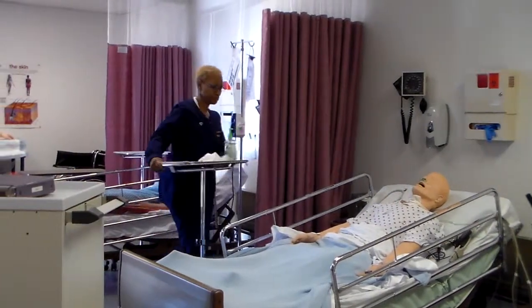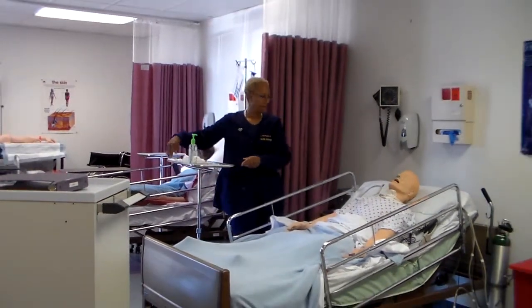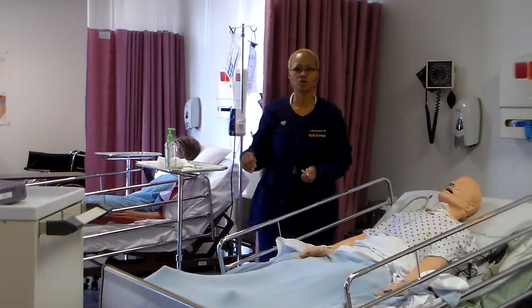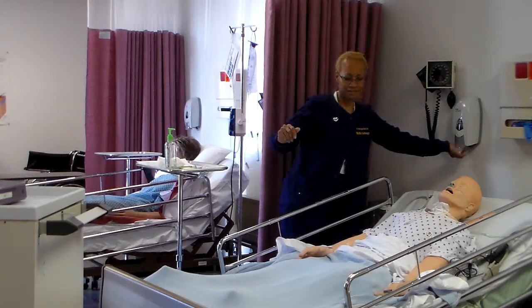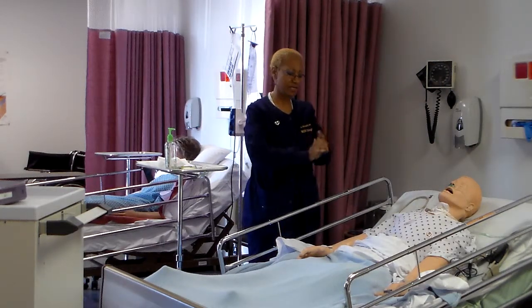Come in and introduce yourself, Mr. Johnson. My name is Annette. I'm your nurse for today, and I'm here to deliver your medication. We've been in earlier, so he's well aware of that. You're going to make sure that you wash your hands. Wash your hands, and then you're going to ID your client.